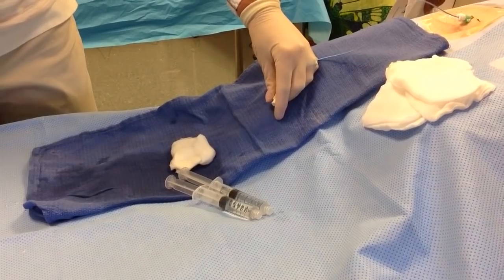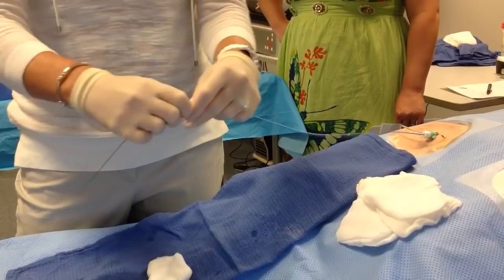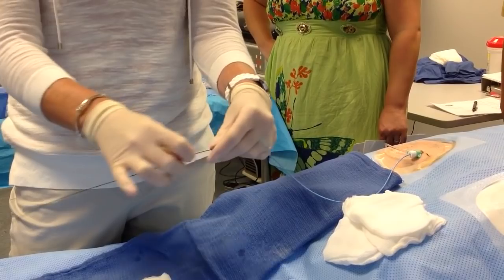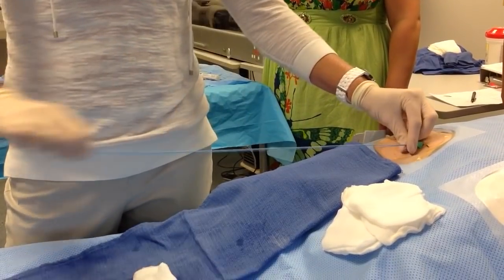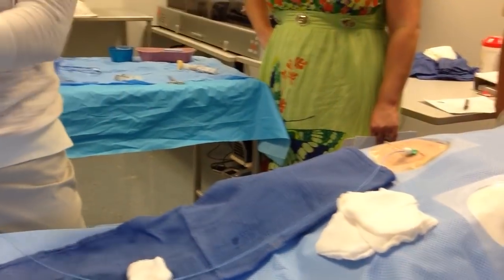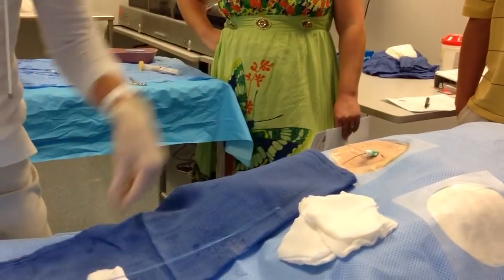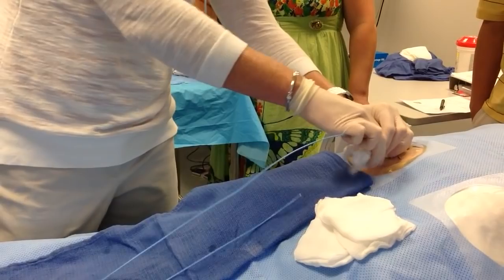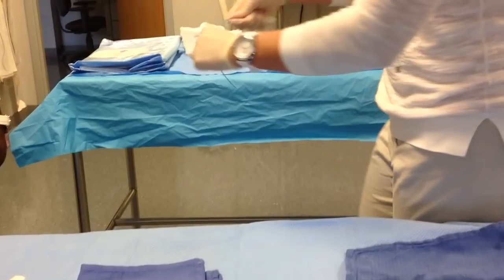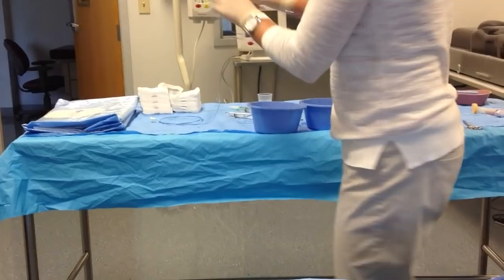I'm going to show you over the wire. So this is if we would do over the wire. And you do short little movements like that. So as we're advancing the wire, we're pulling the catheter out. Usually the doctors are nice and they'll wipe it down for you. But if they don't, this is all you would do. So you wipe it off and you get your JR4. So this is over the wire. Let me put that in there. Should I stab myself?